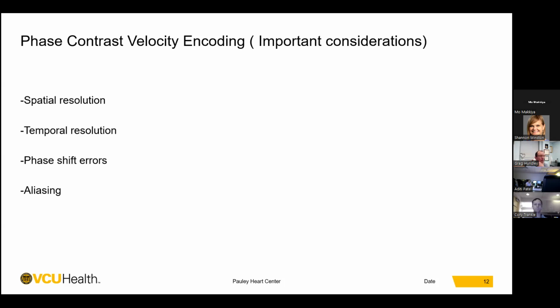Although this affects the accuracy of our velocity measurements, once we reach that in aortic stenosis, it doesn't matter much, as we can establish the velocity is severely elevated.